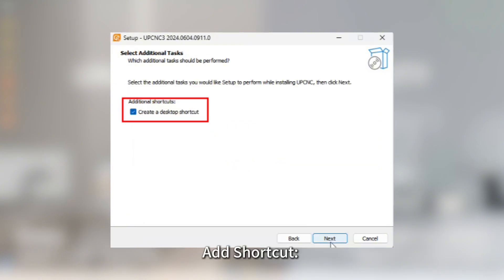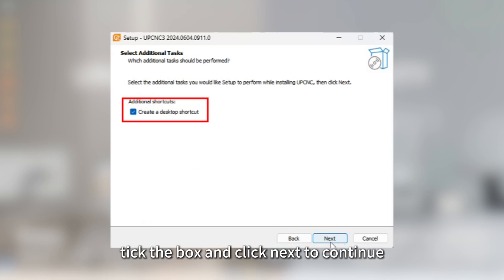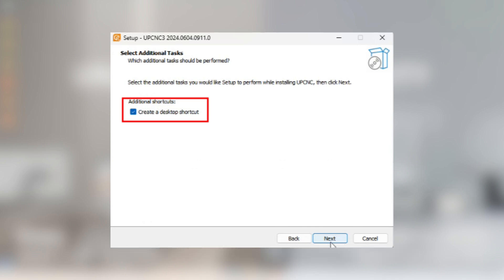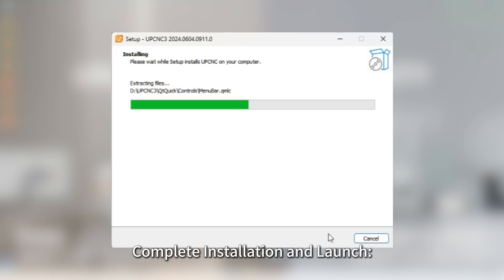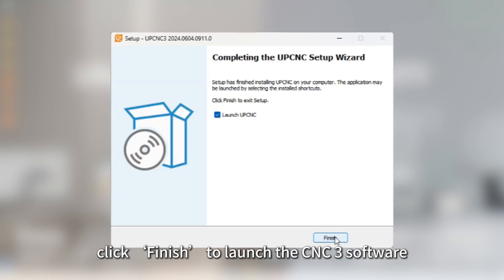Add Shortcut. Select whether to add a shortcut to the desktop — tick the box and click Next to continue. Once the installation is complete, click Finish to launch the CNC3 software.